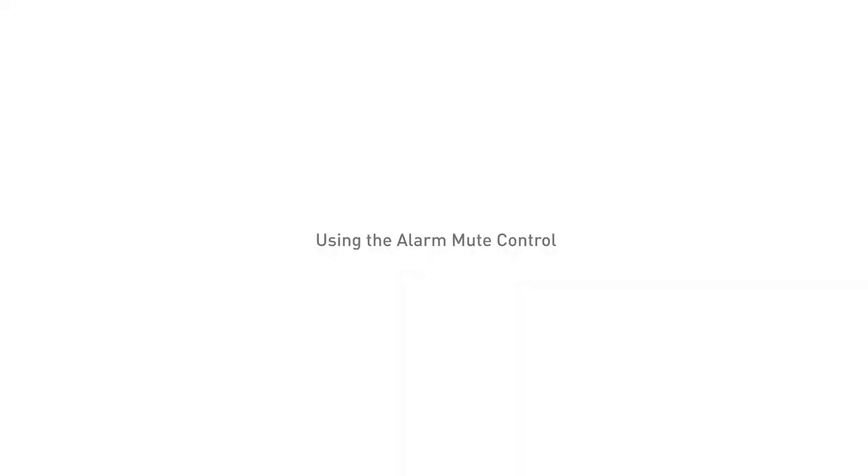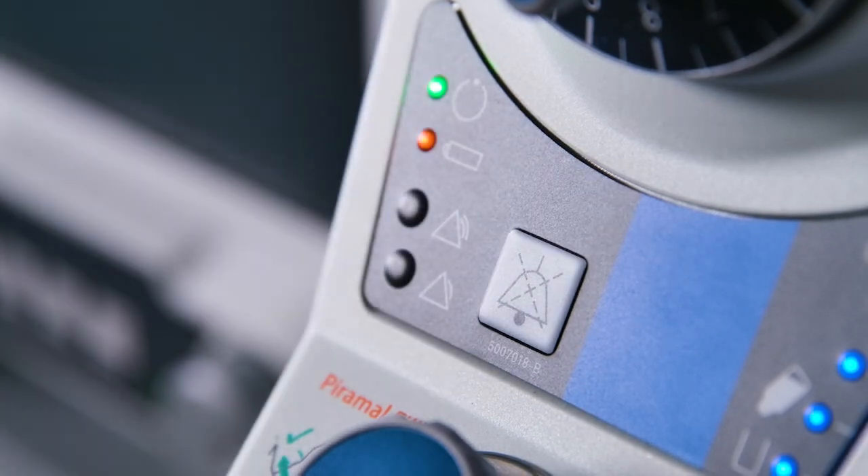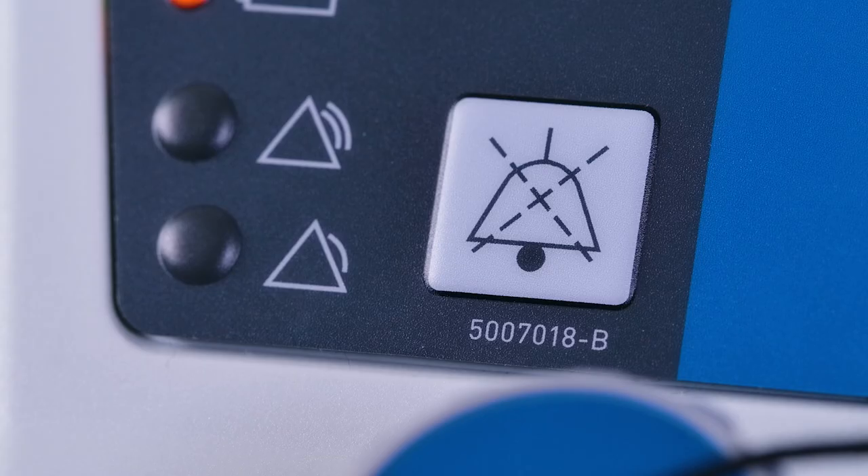Using the alarm mute control: press the audible alarm mute control and the audible alarm will be silenced for 2 minutes. Press the control again to cancel the silence command.